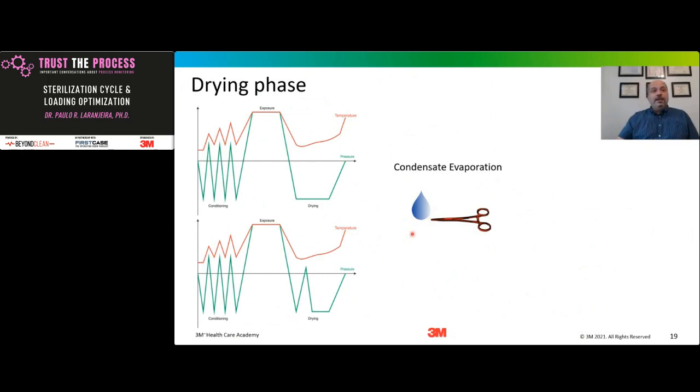At the drying phase, when you reach this point down here, where the temperature conductivity is really bad, because of the plastic of the non-metallic being in the middle of the two metallics, the temperature is going to transfer from those metallics to the non-metallic, and is going to help that condensate to evaporate. So that loading optimization, how to prepare the loading, taking into consideration the metallic and non-metallic, will definitely improve your drying phase.